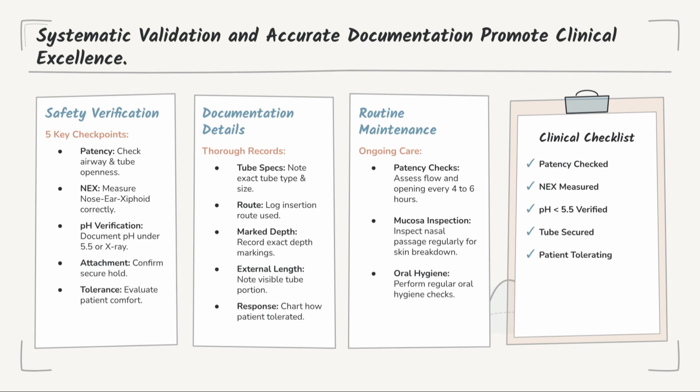Finally, maintain clinical excellence through systematic validation. Document all tube specifications, insertion details, and patient tolerance. Perform ongoing maintenance, including regular patency checks, mucosa inspections, and oral hygiene, to ensure continued safety and comfort.